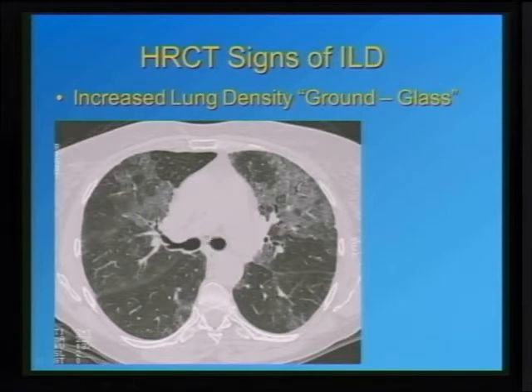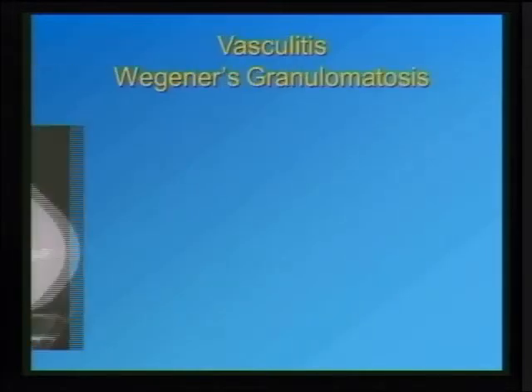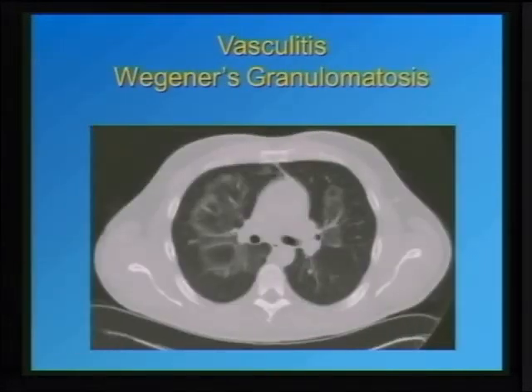So there is actually advanced ground glass opacity. It's not as dense as you typically see in airspace disease. You may see a few air bronchograms, and it most of the time has this geographic distribution. This is a patient with lupus pneumonitis and early changes of ground glass inflammation. Just remember that in lupus pneumonitis, you may also get infection or hemorrhage that can mimic this appearance. Distribution, but more importantly evolution of the disease, will help you differentiate between those different entities, and of course the clinical condition, the fever, and so on.